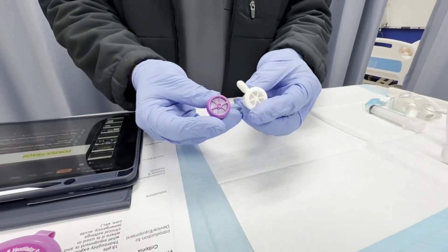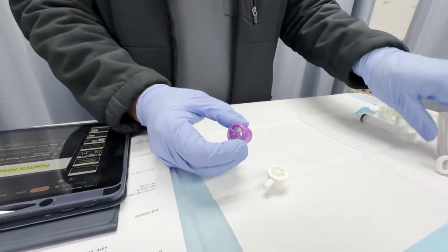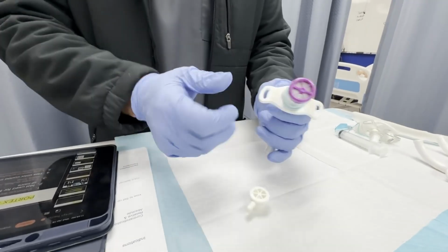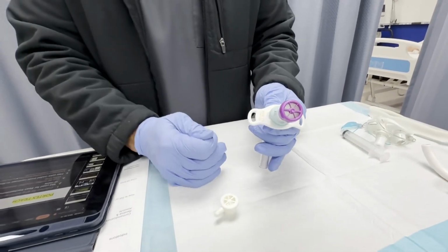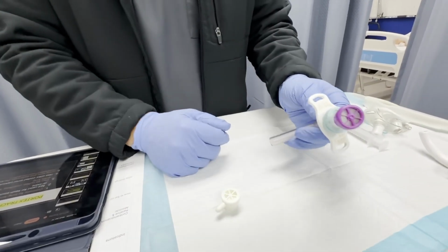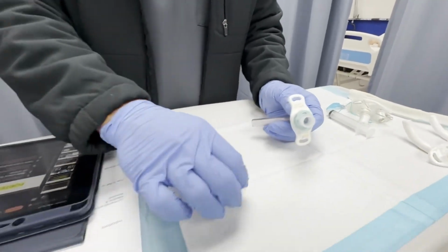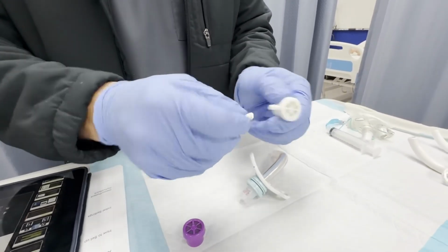Here we actually have Passy-Muir valves, or a talking valve, right? You will go ahead and put this at the tip of the trach like that, and this allows the patient to be able to speak. It allows air to go in but not out, so that the air can go up through their airway, through their vocal cords. This one is a Shiley. Same thing. This one just has a little port that you can connect O2 to if you needed to. And that's pretty much it, y'all.